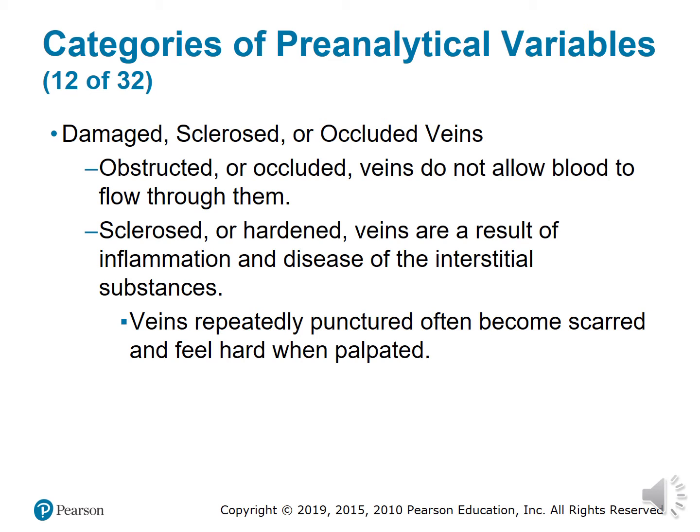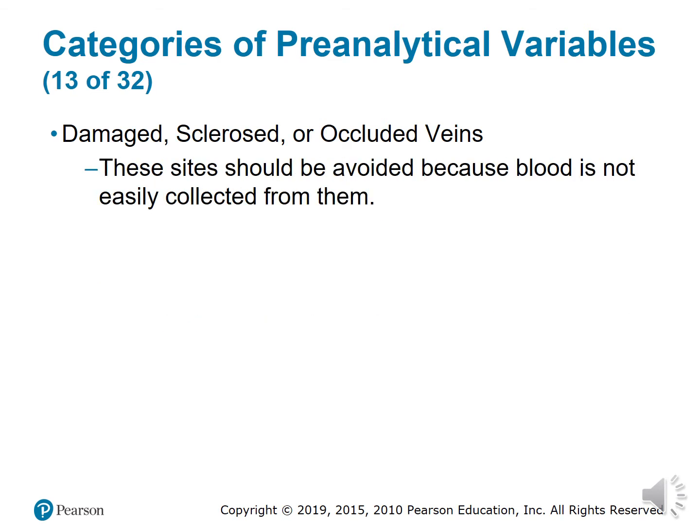The phlebotomist may have to use a longer needle just in case they have a higher fat content, because the patient's veins may be deep inside the arm. Please, and this is a very important afternote, do not, and I repeat, do not always follow the standard. Some obese patients have great veins, and as soon as you place the tourniquet, the vein pops up for you to draw with a regular size needle. So not all the time would you need a longer needle. You can use a regular needle.